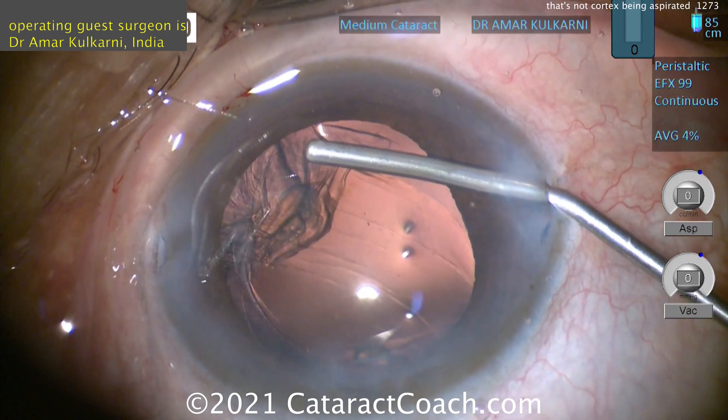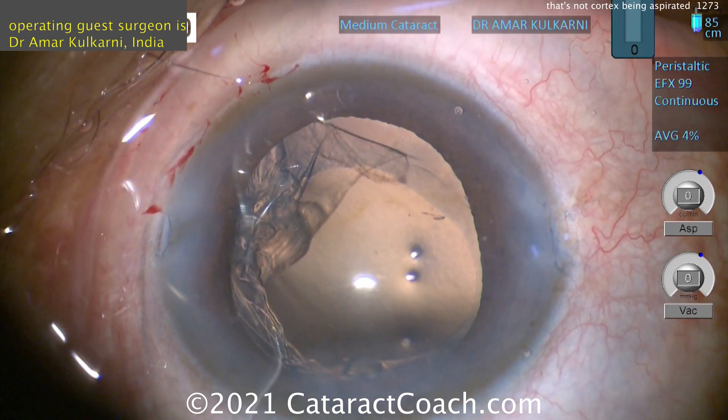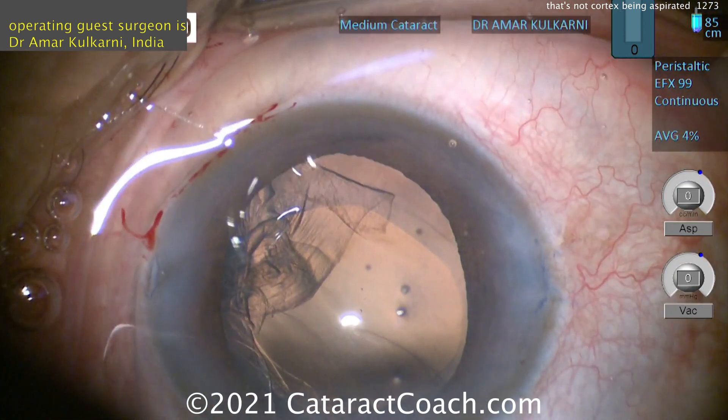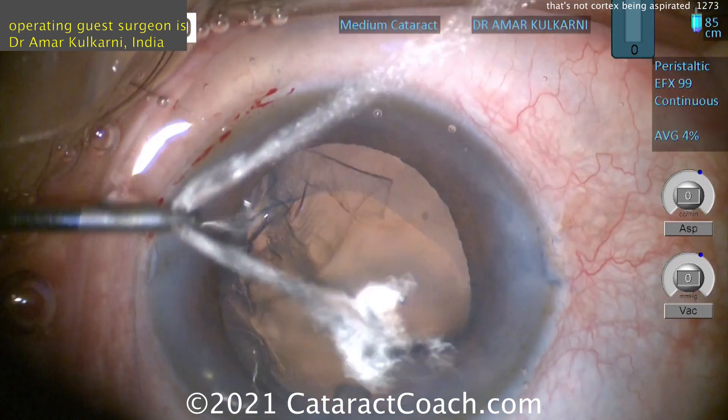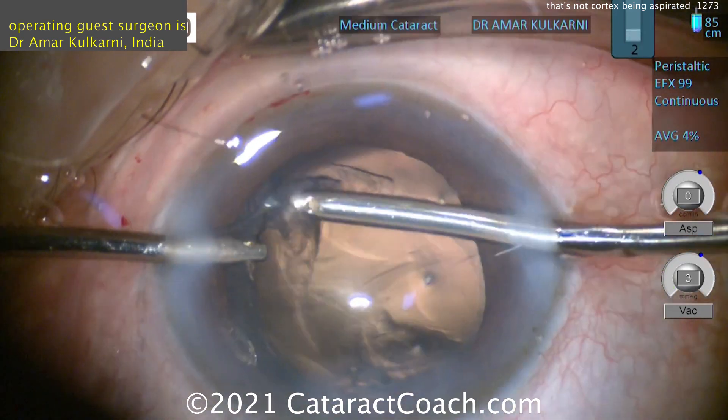So you need to make sure that the anterior hyaloid face stays intact. Lots and lots of viscoelastic. This is a stressful case — you've got to keep calm under pressure when you're doing this. Dr. Kulkarni is doing a really good job here, staying calm. Plenty of viscoelastic. Remember who told you: viscoelastic is cheaper than vitreous.